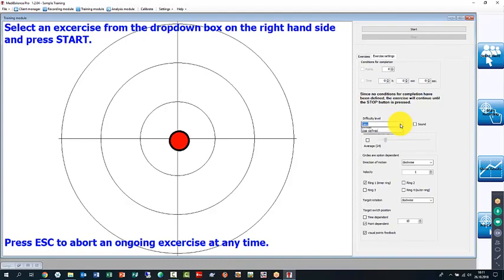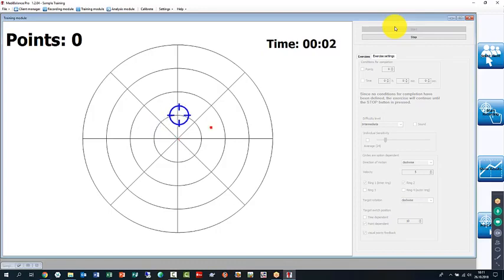So I'll go from easy to intermediate. For that one, I'll probably have to stand on the platform because else I will not succeed to stay inside the blue dot. So what you do is you try to follow it, which is already very challenging. And now it's even apparently faster, and now you do the same thing over in the outer module, and you can see that, particularly if you're talking while you're doing it, is a challenge in itself.